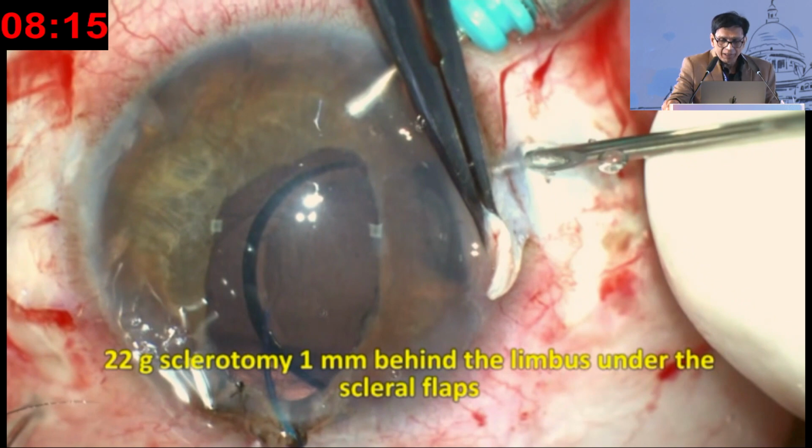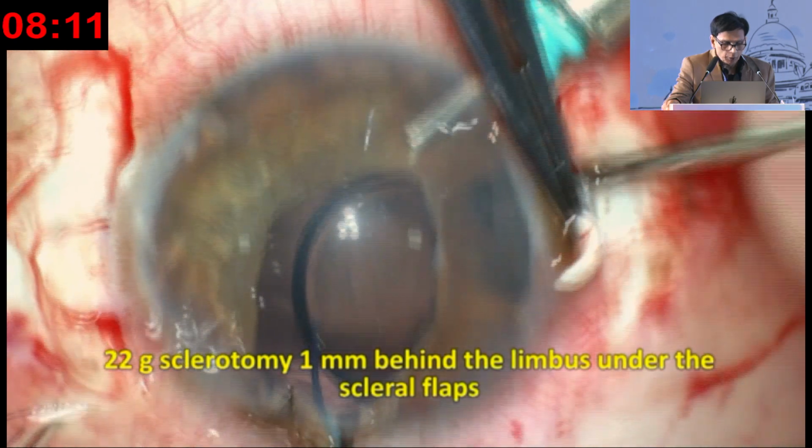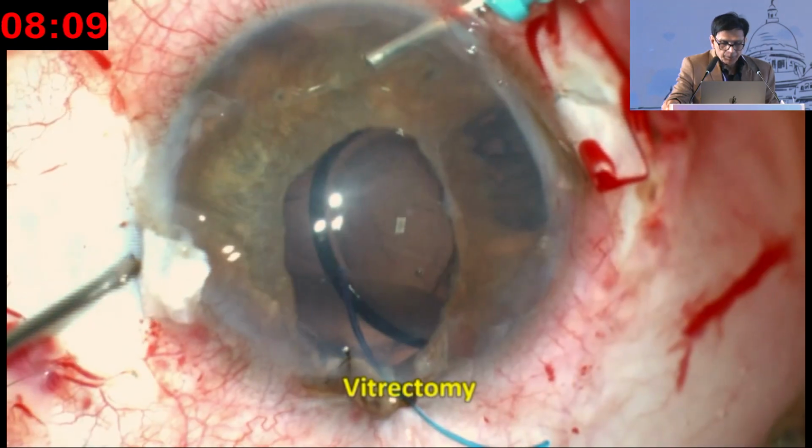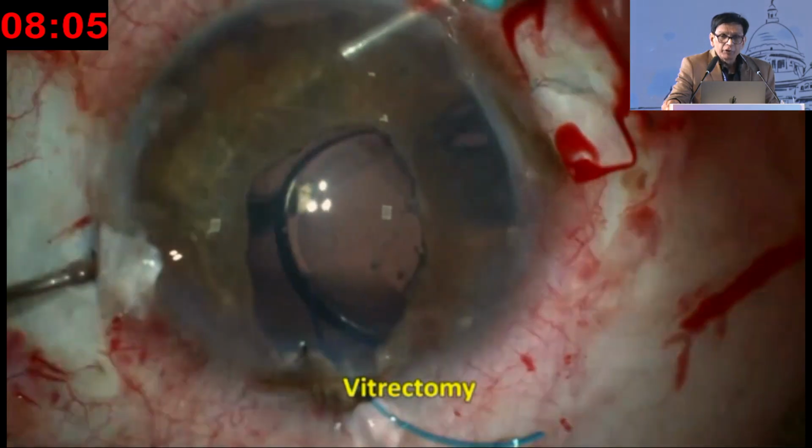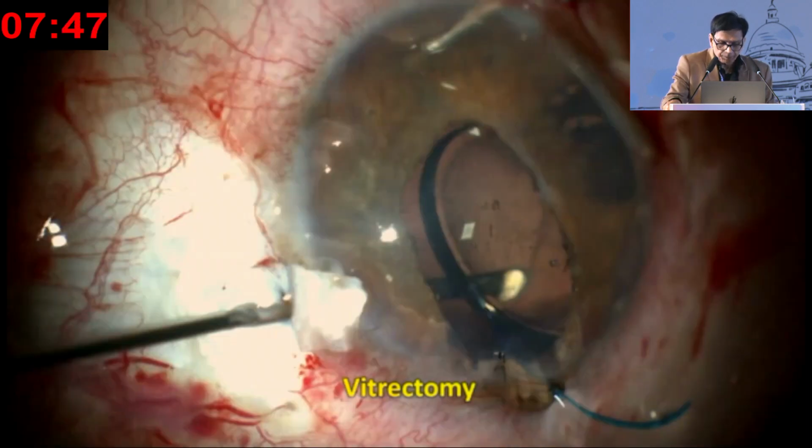So you see I made my two scleral flaps. I'm now making my 22 gauge sclerotomy 1 millimeter behind the limbus. Now my next step is to do vitrectomy. I've got a trocar AC maintainer, and I advise everyone to move to a trocar AC maintainer. The same retinal trocar can go in the anterior chamber, 0.5 millimeter from the limbus, going through the sclera. But the advantage is you know where the cannula is, rather than when it's in the pars plana.